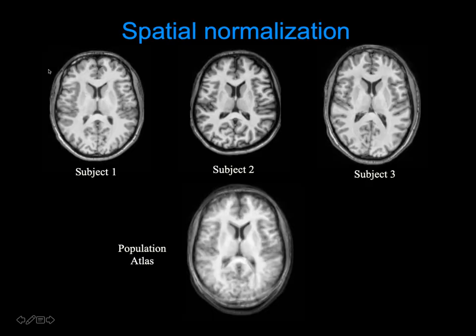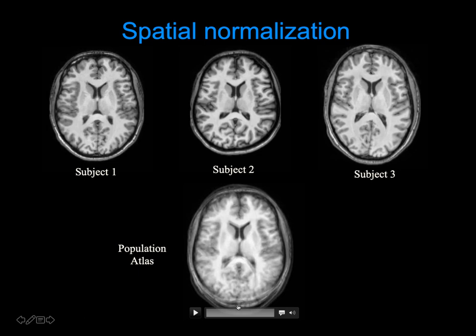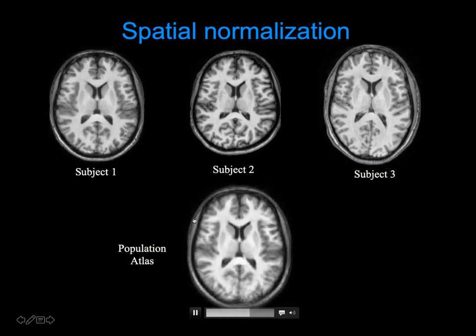I'm not aware that we had in this summer course anything about brain morphometry. But if you think about the way we typically analyze imaging data, beyond what a radiologist could do, we have different brains with different shapes. And if we want to do any voxel-wise assessment of what's going on in the brain, we need to morph the brains from their original shape into a target template, okay?